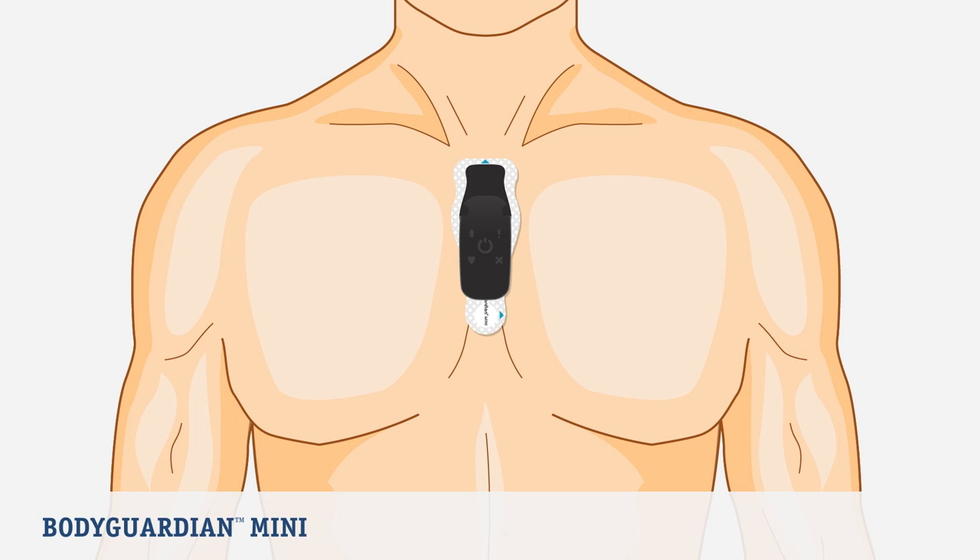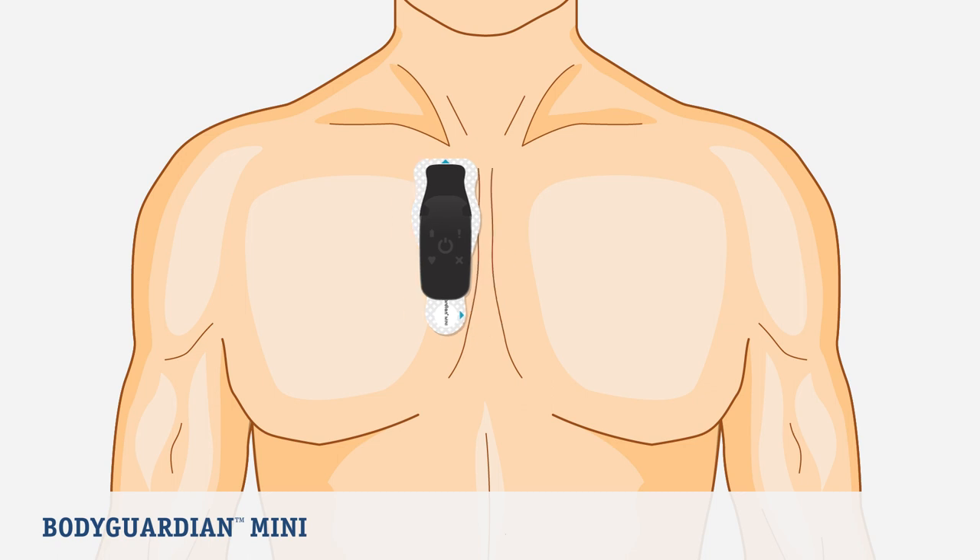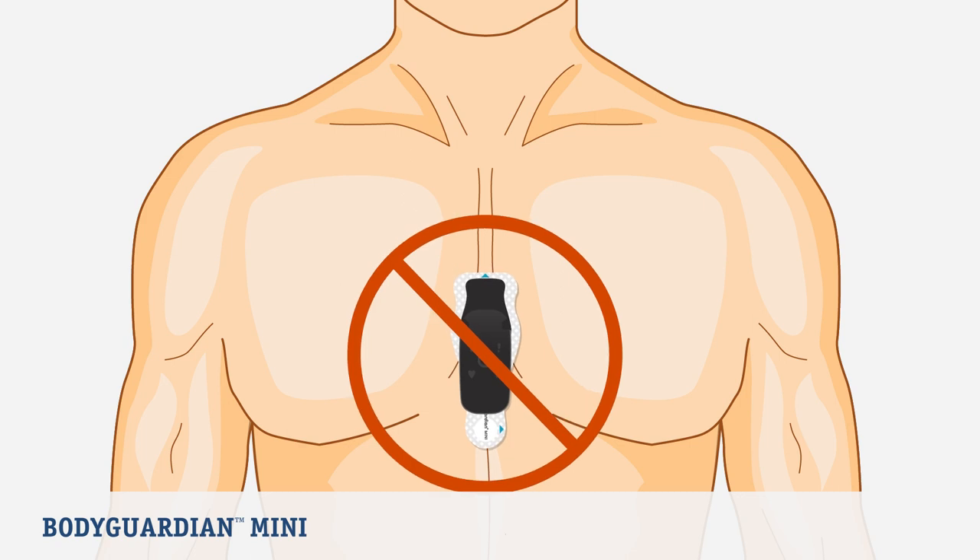Now it's time to place the BodyGuardian Mini on your chest in your selected location. If you choose the preferred vertical placement, place the top of the strip just below the jugular notch at the base of the neck, at the intersection of the collarbone. Do not place the strip too far to the right or too low.